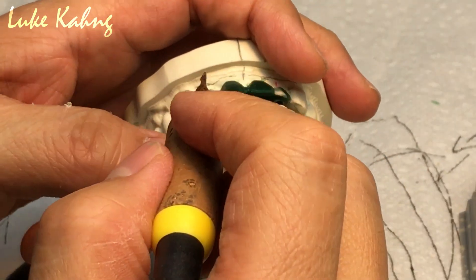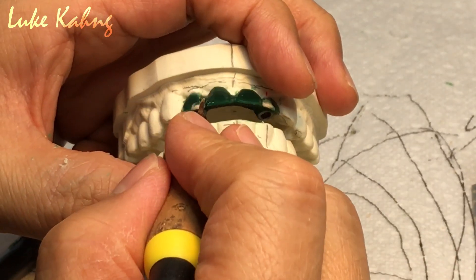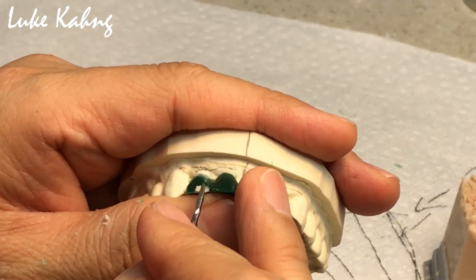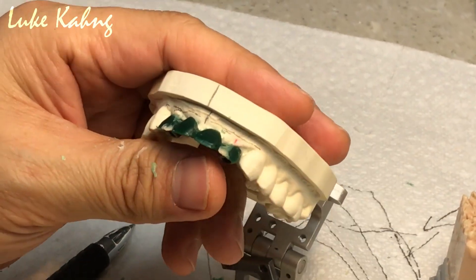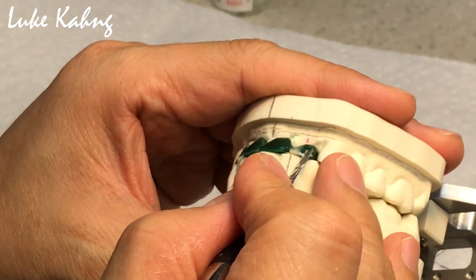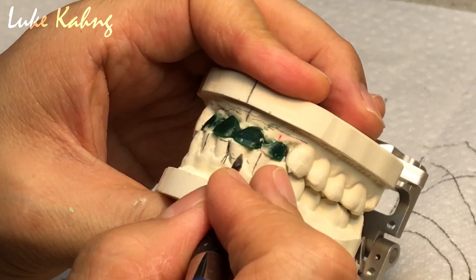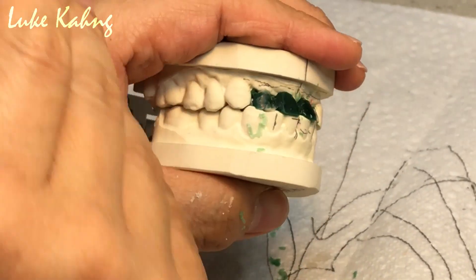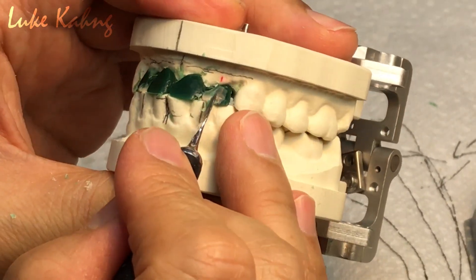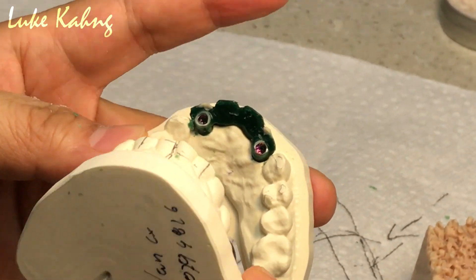But I'm going to add. Getting better. That's what I need. Right open. Now it's good. Here horizontal, facial view — I don't need thick here, but I need a certain thickness, then I'm okay. I don't need super thin, I need a certain thickness here. Same thing here — it's pretty good. And then I can make the same length, and then a great contour. Slightly overjet — slightly. You cannot make it perfect, but you can see little bit it stays in. So this is the guide, we have to add a little bit.